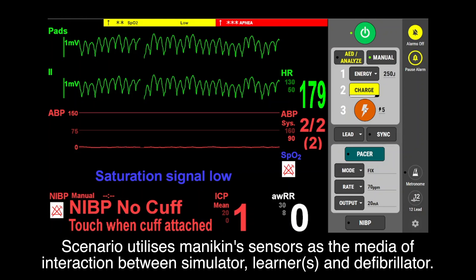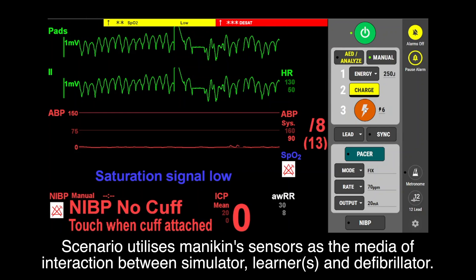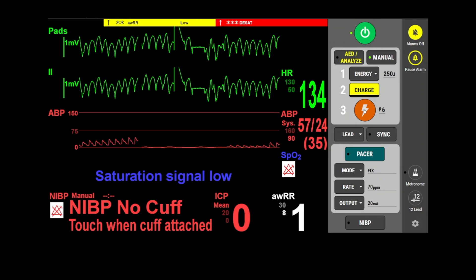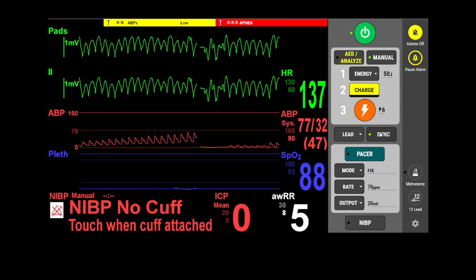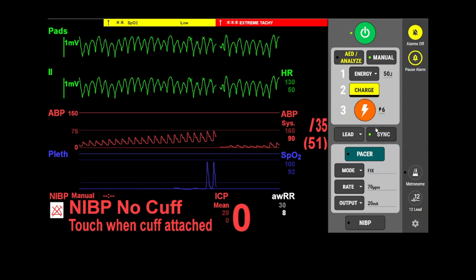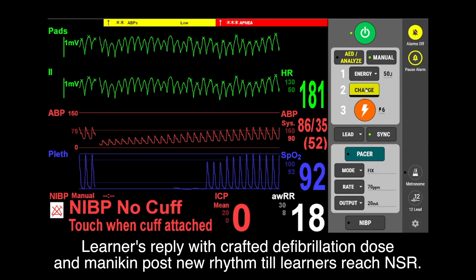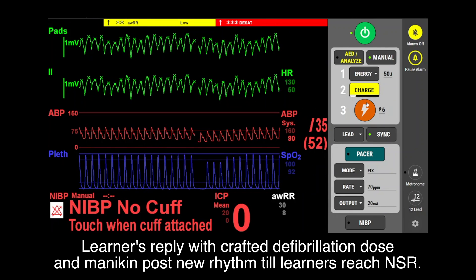The scenario utilizes the manikin's sensors as the medium of interaction between the simulator, learners, and defibrillator. Learners reply with a crafted defibrillator dose, and manikin posts a new rhythm until learners reach normal sinus rhythm.